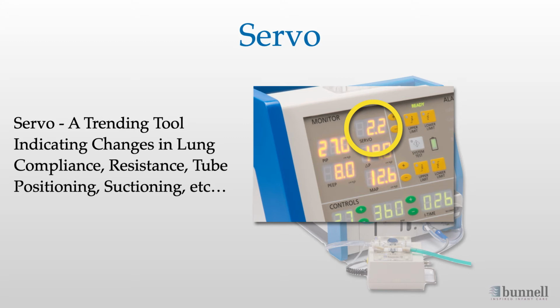for further evaluation. An increase from baseline value or a high servo alarm may be related to a leak around the endotracheal tube or improved compliance. More flow is being used to maintain the set jet peak inspiratory pressure, therefore more tidal volume is being delivered. Often a cause may be an endotracheal tube leak that happens after repositioning of patients. If a change in endotracheal tube leak is not the cause, contact the respiratory care team for further evaluation.